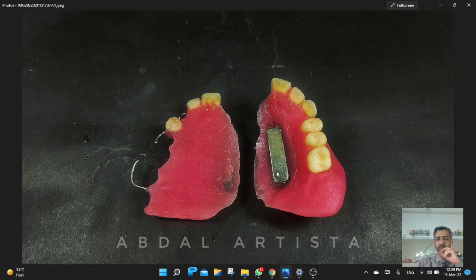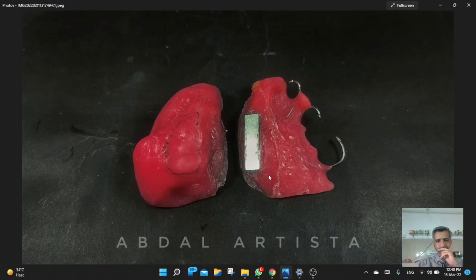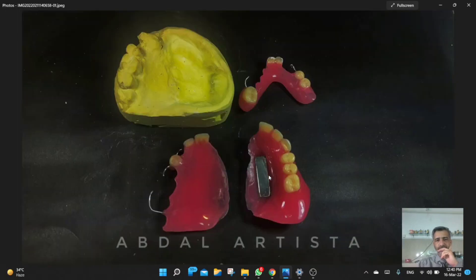The magnet is large in size and the expectation was that it would have stronger pulling force to keep the prosthesis in its position. This is another view, and this is the final prosthesis after polishing. We had made a couple of duplicate models — this part was flasked and processed in one flask, and the other part was processed in another flask on a separate duplicate model.